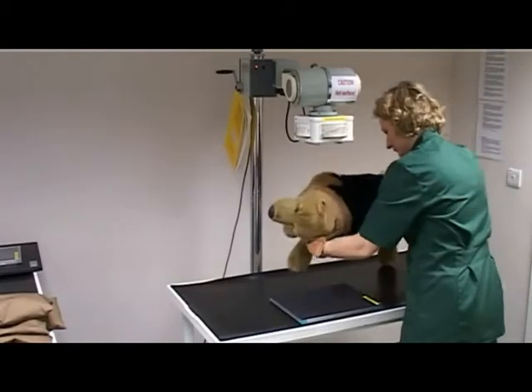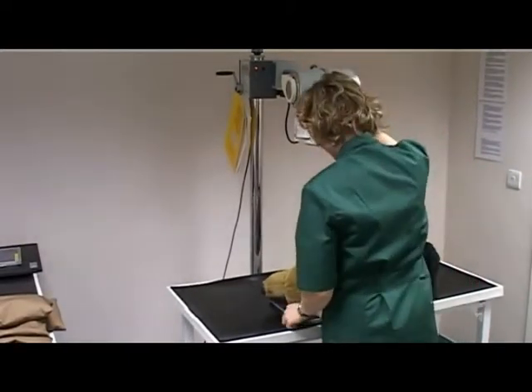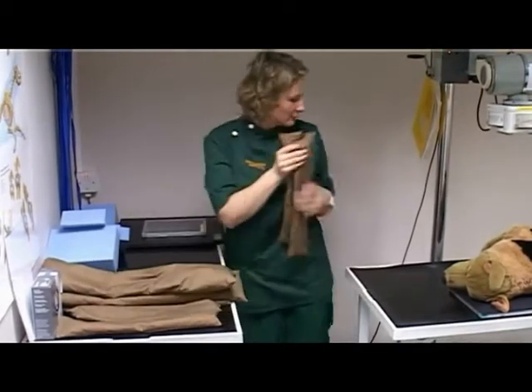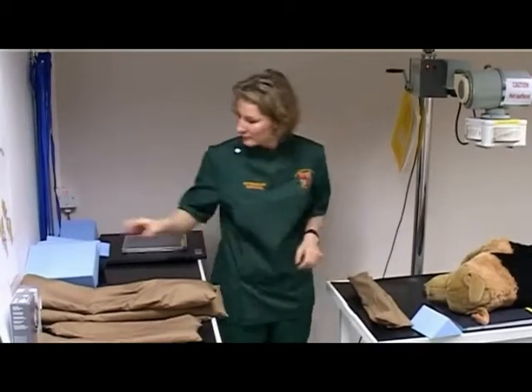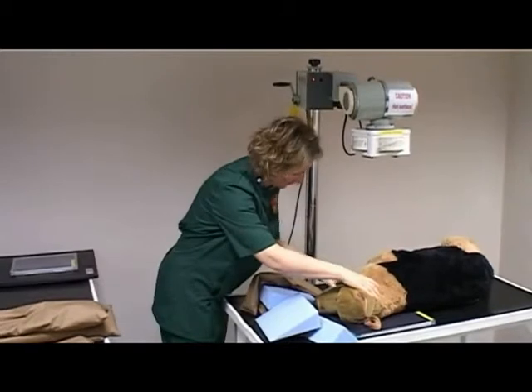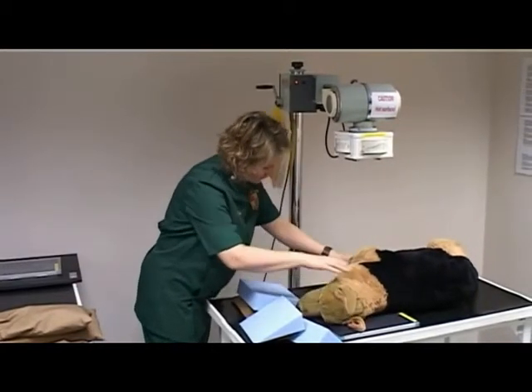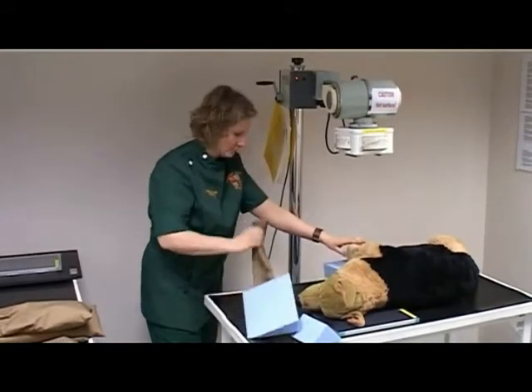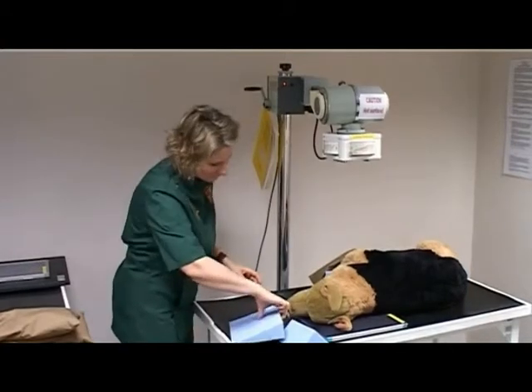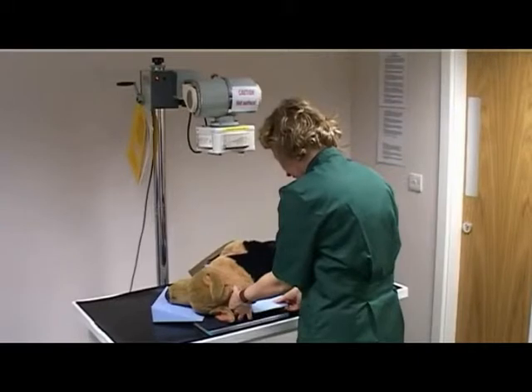Place the patient in lateral recumbency with the neck or cervical spine positioned on the cassette. Select the positioning equipment. Draw both forelimbs caudally and place a small foam wedge between the forelimbs to ensure that the median plane is parallel to the cassette. Secure each forelimb with a sandbag or tie. Place a small foam wedge under the nose to correct rotation of the head, and a small foam wedge under the neck to correct sagging of the neck.